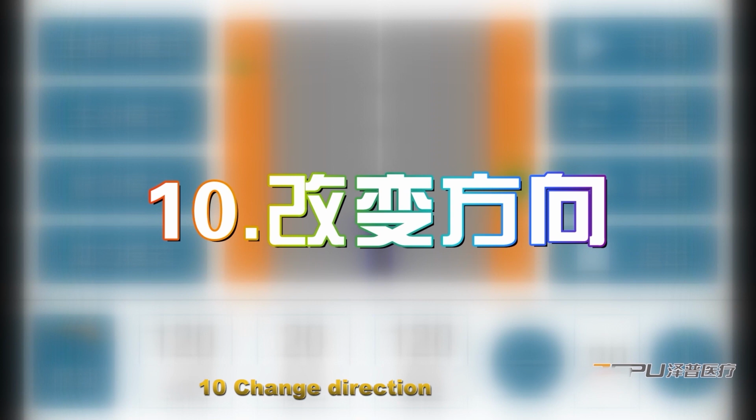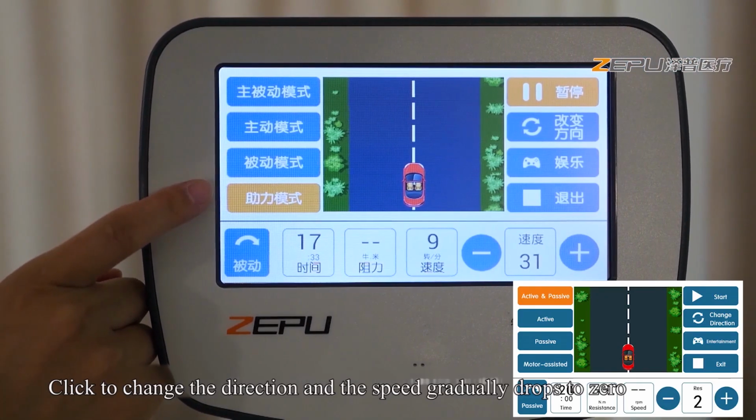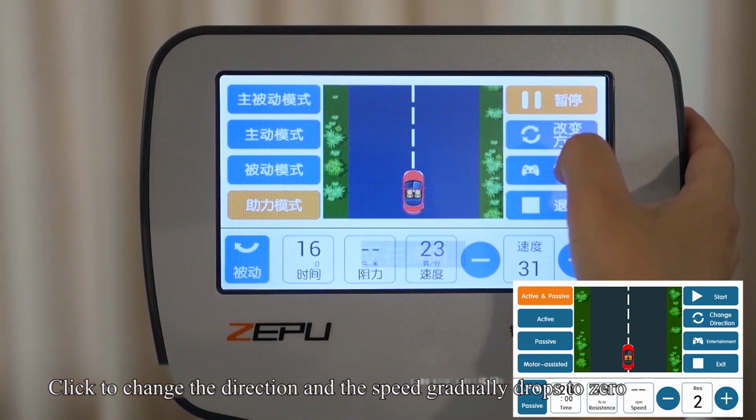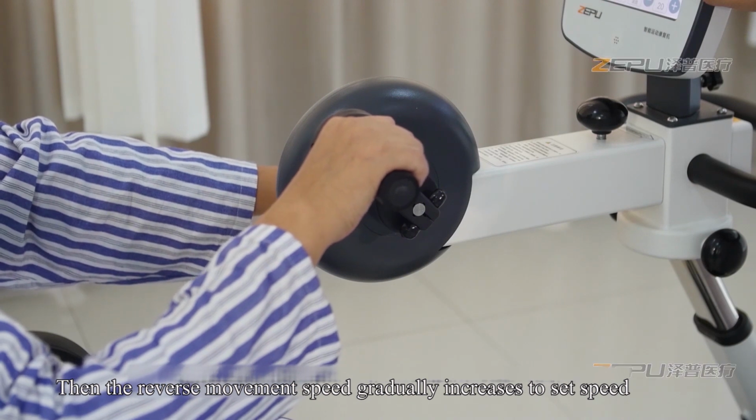10. Change direction. Under the premise of passive training, click to change the direction and the speed gradually drops to 0. Then the reverse movement speed gradually increases to set speed.